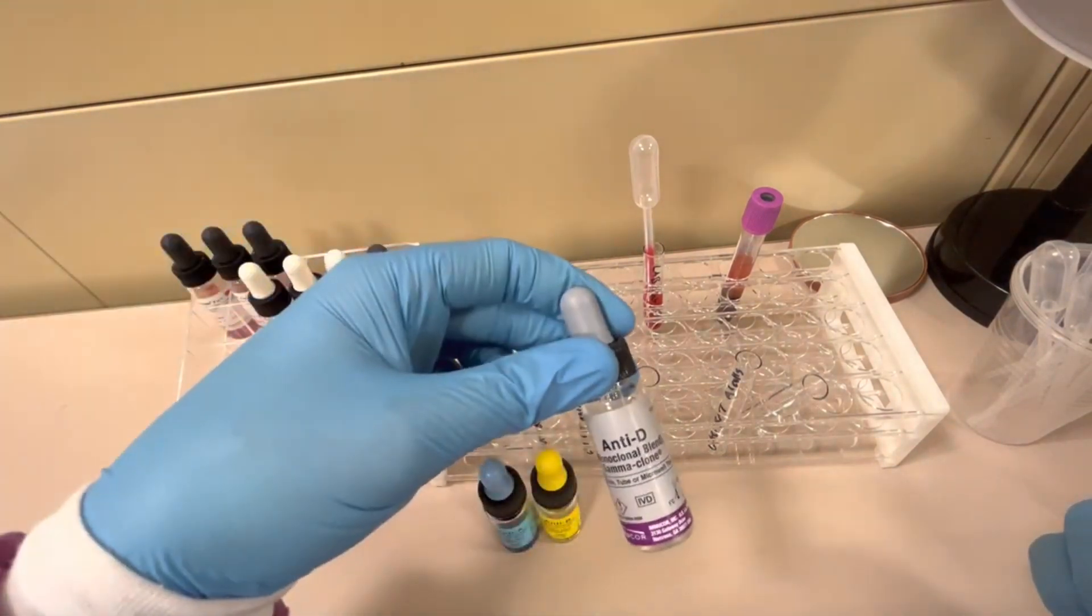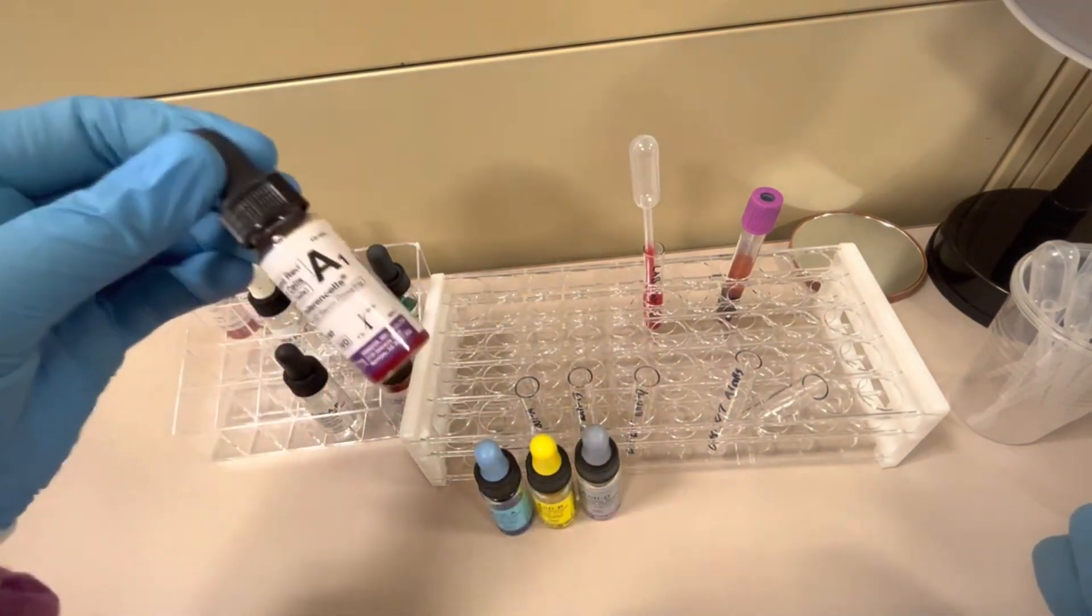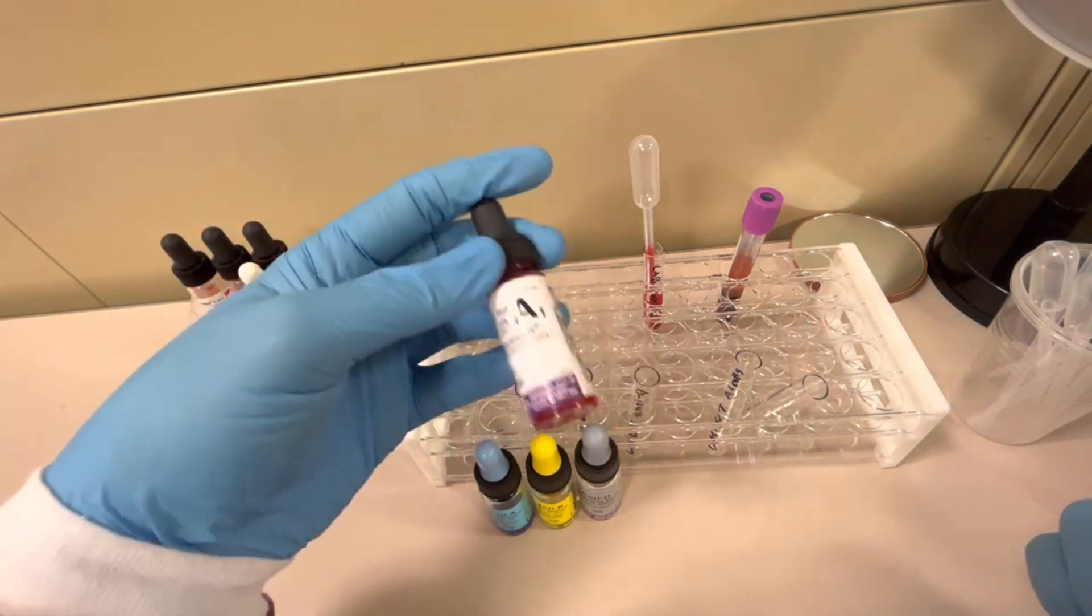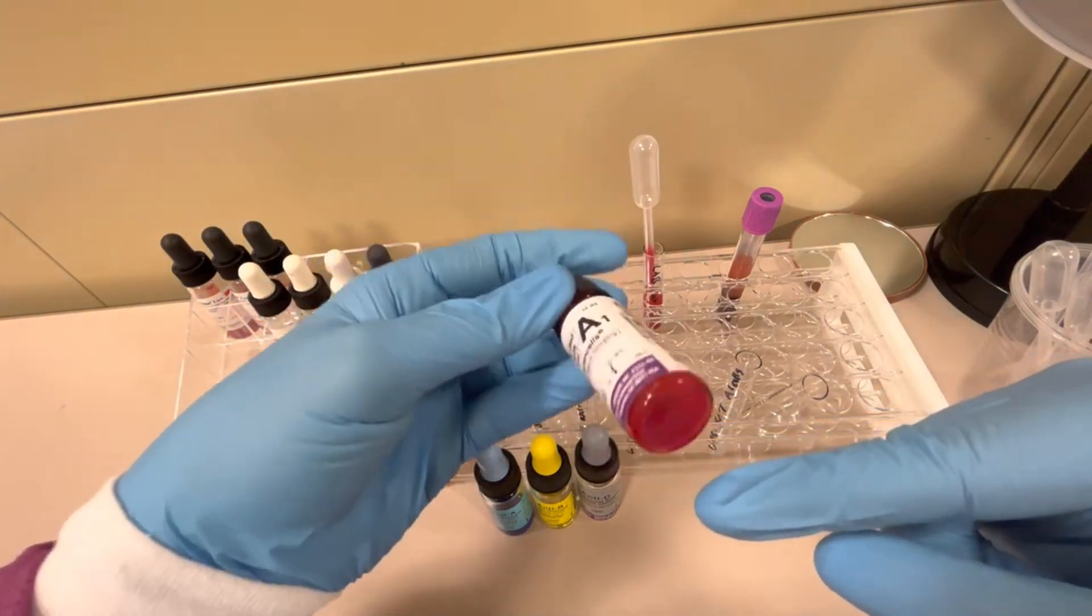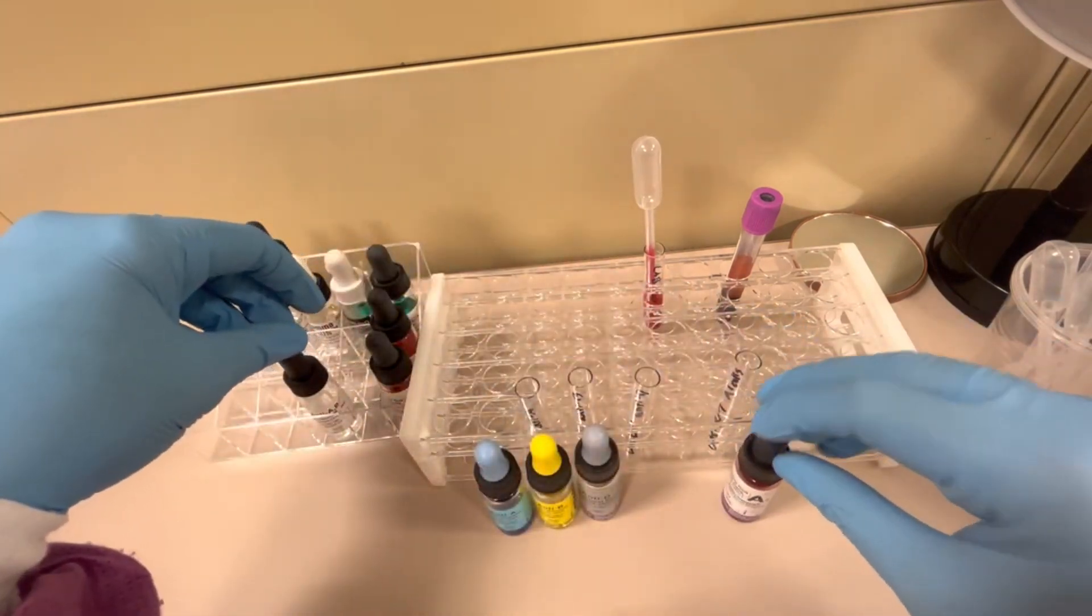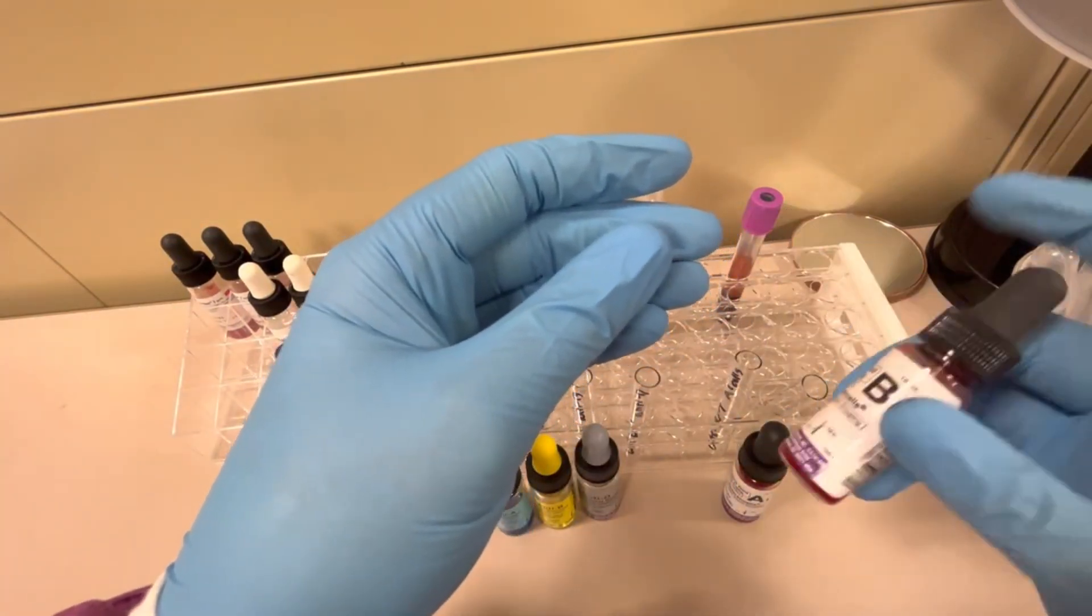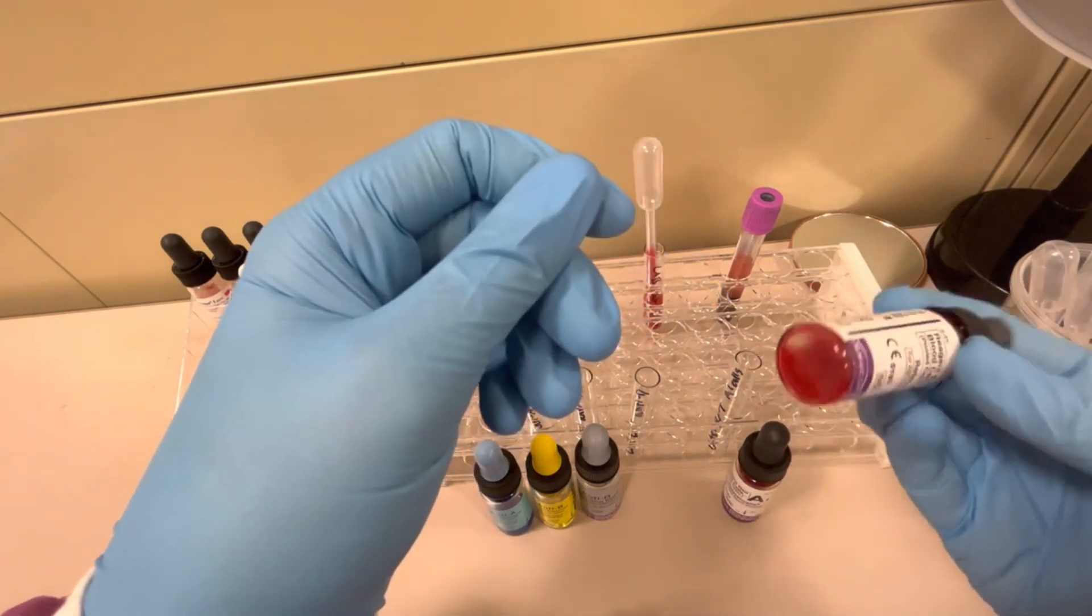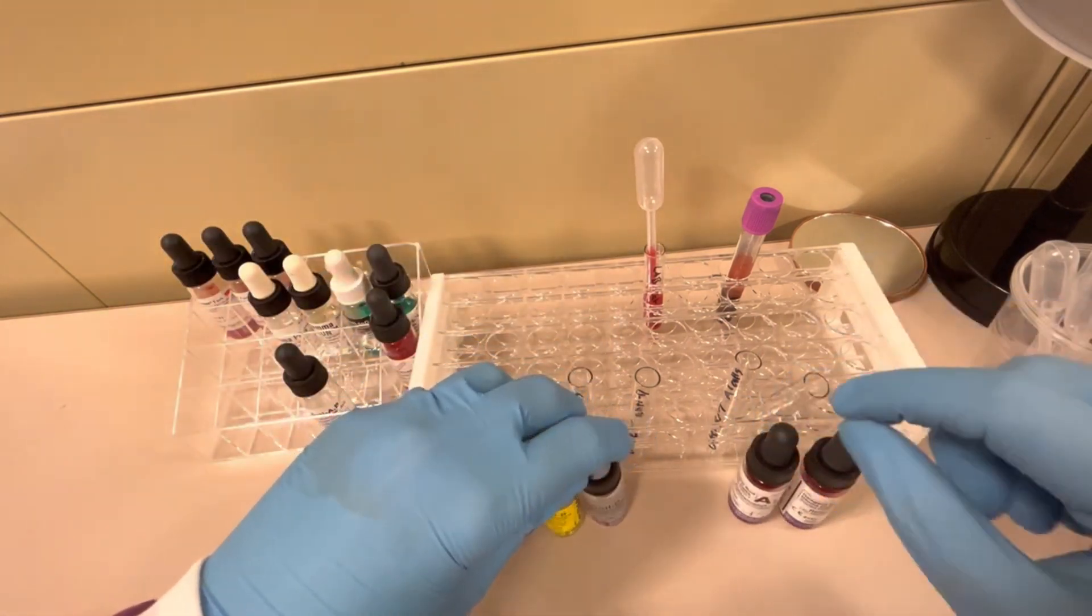Anti-D. These are going to be for my front typing, my forward typing. And then we have A1 cells. Notice that these are red blood cells, so we want to have these properly mixed so that all the red blood cells are off the bottom of this vial. We want to do that every single time. And then B cells. Again, these are red blood cells with known B antigen on them. We need to make sure that the red cells are off at the bottom.